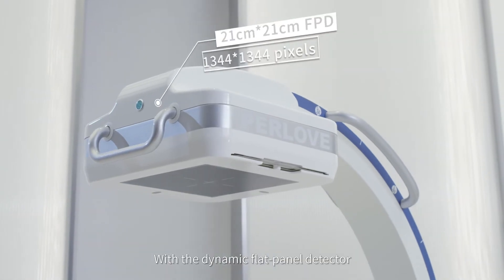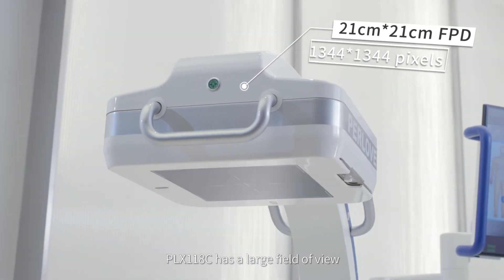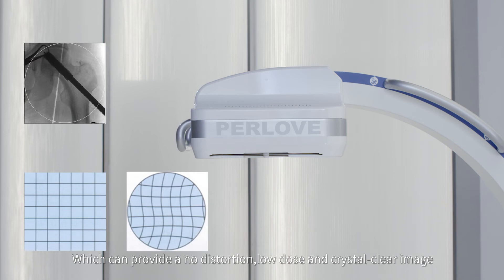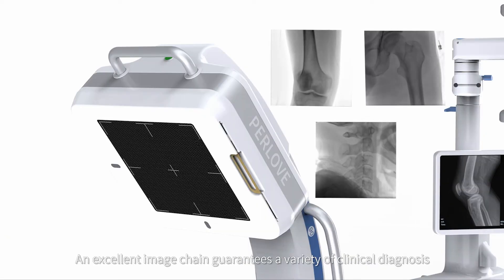With a dynamic flat panel detector, the PLX118C has a large field of view, providing no distortion, low dose, and crystal clear images. A wide dynamic range, high DQE, and low noise level — an excellent image chain that guarantees a variety of clinical diagnoses.